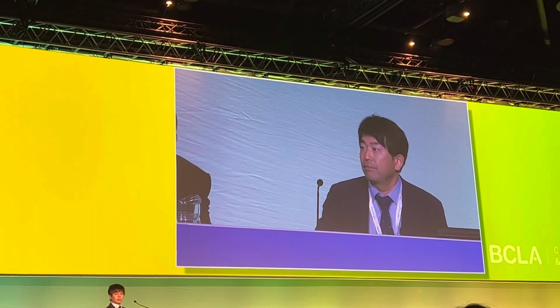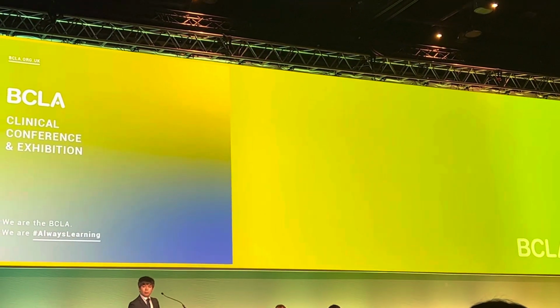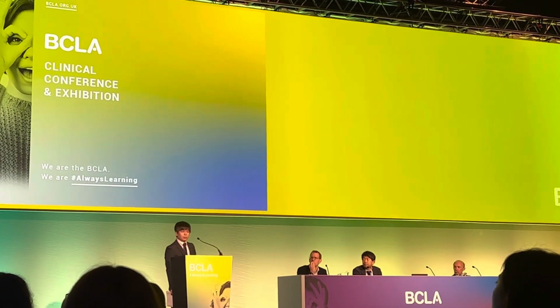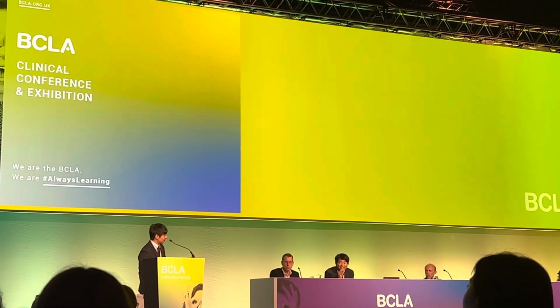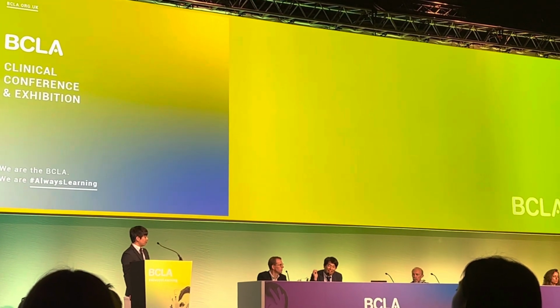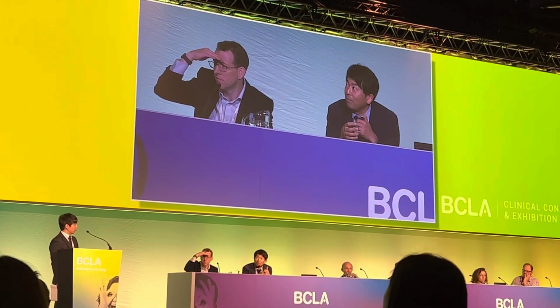Hi, Craig Woods. I may have missed this, but when you fitted the contact lens, did you do an over-refraction to optimize the vision? Yeah, I will answer. AMMF data is already shown. The AMMF has a little bit more myopic power than the DT1.